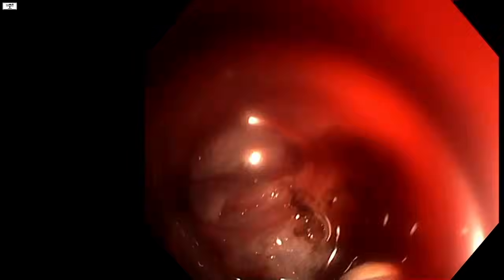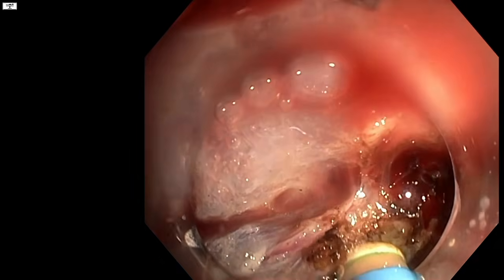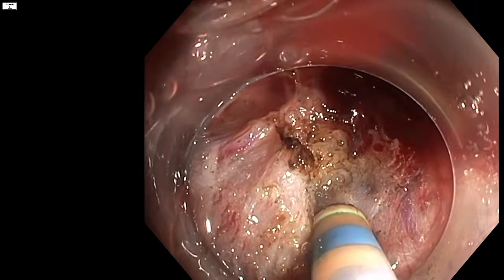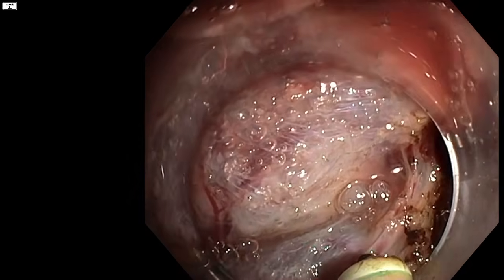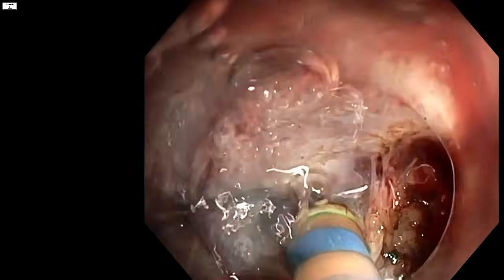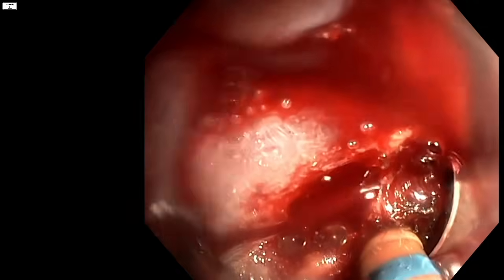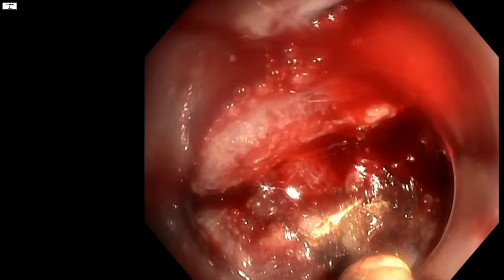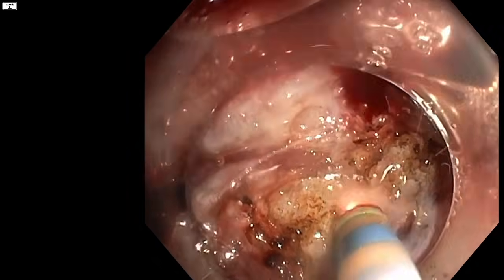So blue on the right, injecting it deeper than the muscle retracting sign. Trying to go slowly to the opposite side. So we see some blue on the left. We progressively see the muscle retracting sign which is inside the lesion. So always I inject at the left part, trying to create blue at the right part, and at the end we have to cut. And you see that it's sometimes difficult to see the whole area and to see how deep we should catch and how deep we should cut.